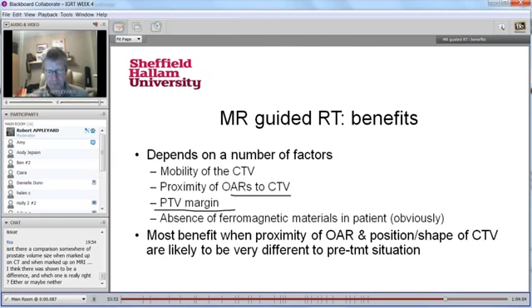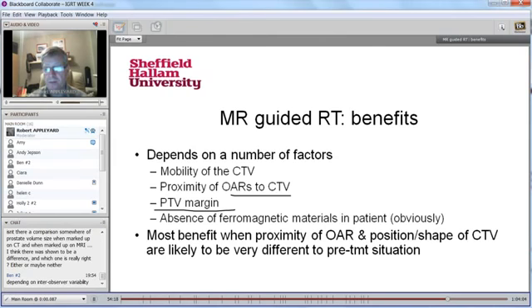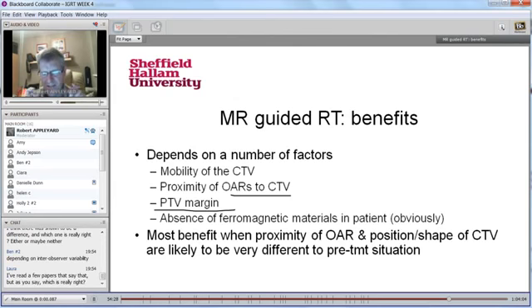There is also the strength of the magnetic field. The higher the field strength, the greater the extent of that geometric distortion. And there are other inherent things that will influence that, such as how stable the magnetic field is. That's an issue with MR Linacs, although generally they've been designed so the magnetic fields are very stable, but they're not as perfectly stable as diagnostic quality scanners, is my understanding. But we're talking about very small amounts. Also there are patient inherent things that will affect the magnetic field and therefore affect the spatial distortion as well.